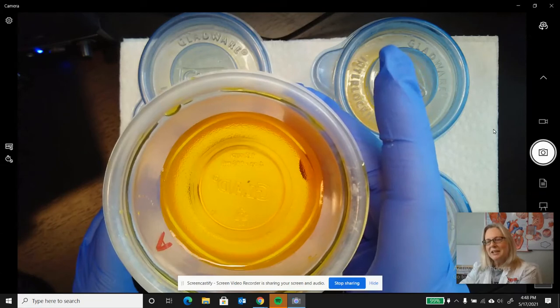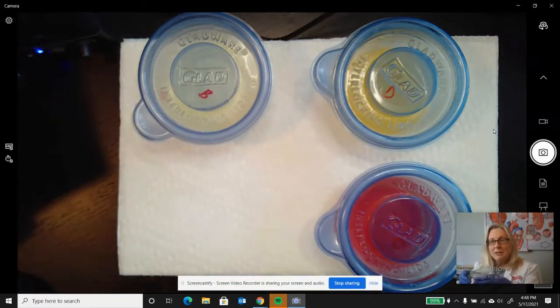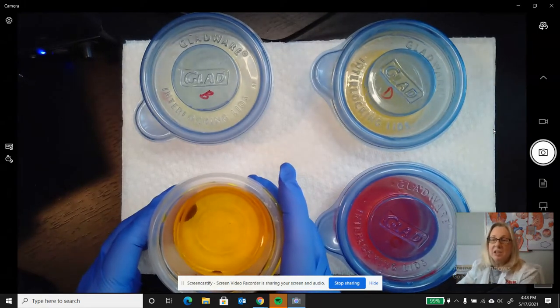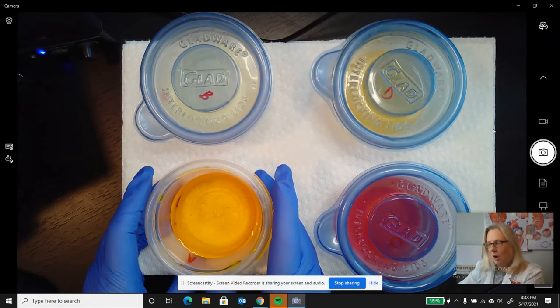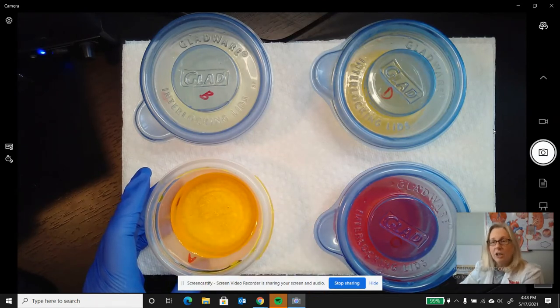Perfect. The next thing is the smell. Lucky me. Here I go. It's coming to my nose. Wafting. It actually has just a light odor. It's not too bad. It doesn't smell too bad. So that's a plus for me, right? Good thing I did the wafting though. All right. So this one we've got color, clarity, and the odor is not bad. It's actually a light odor. So that's good.